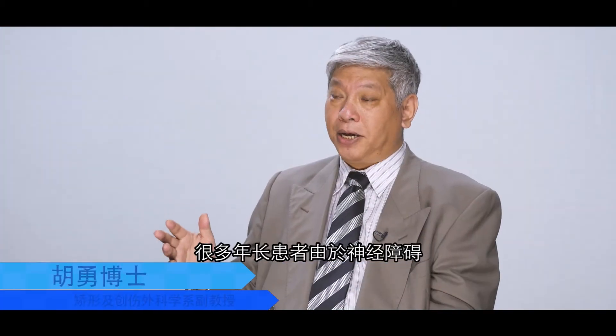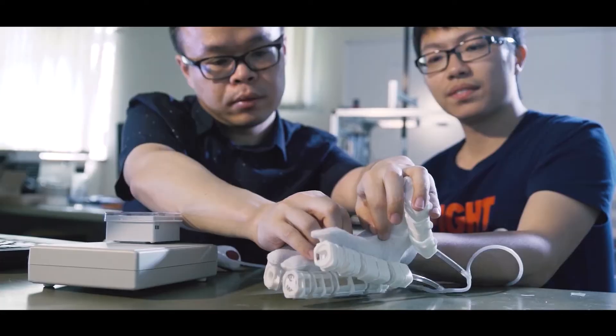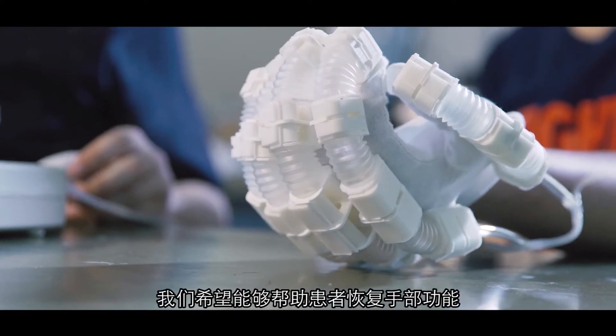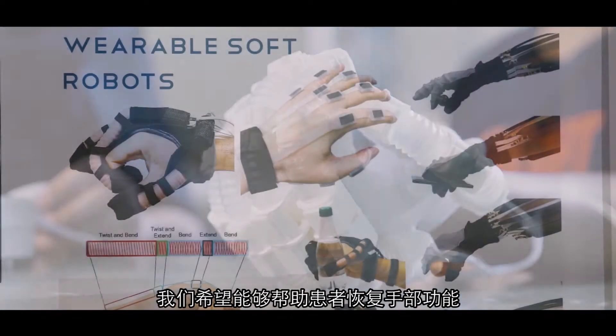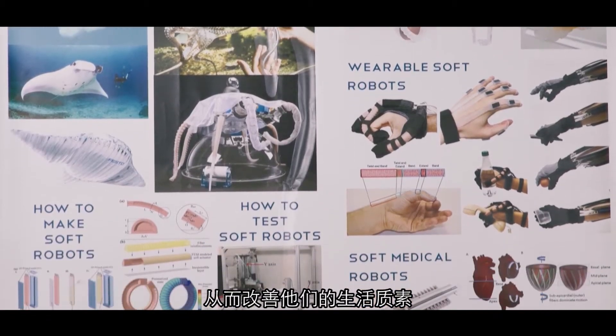A lot of elderly patients lost their hand function due to neurological disorders. With this soft robotic hand, we hope we can have those patients get the rehabilitation and regain their quality of life.